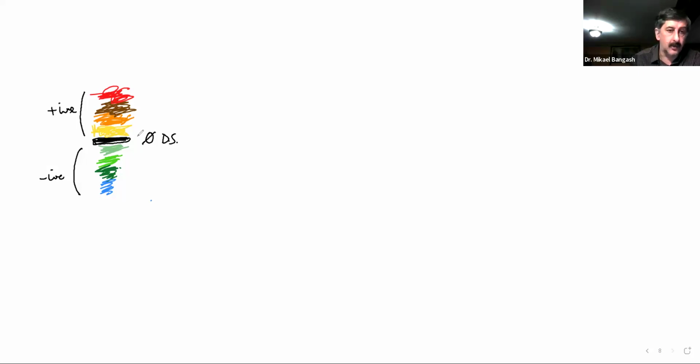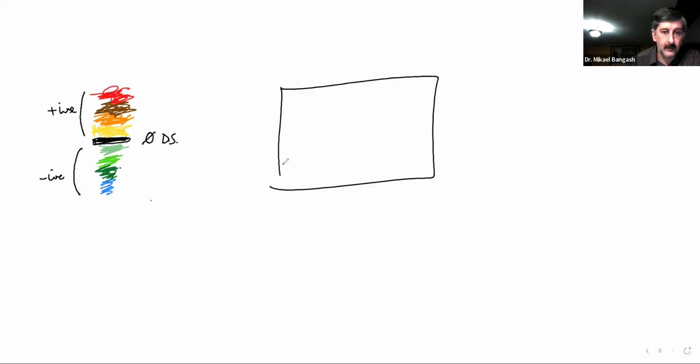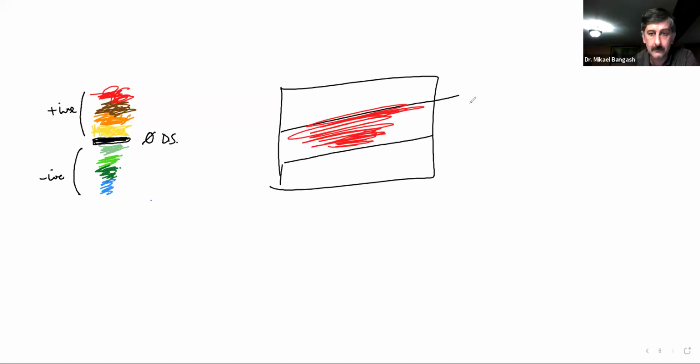Now as I say, color Doppler, so that's going to be, for instance, your blood vessel, maybe filled up with any color. Let's just say it's red. In this instance, what is it that the red will tell us?